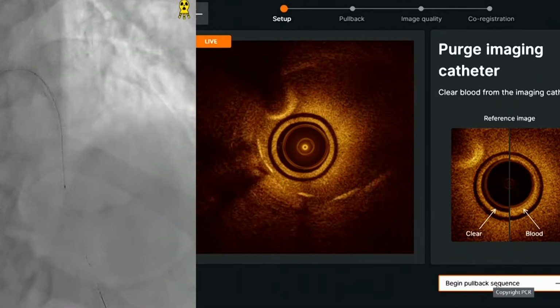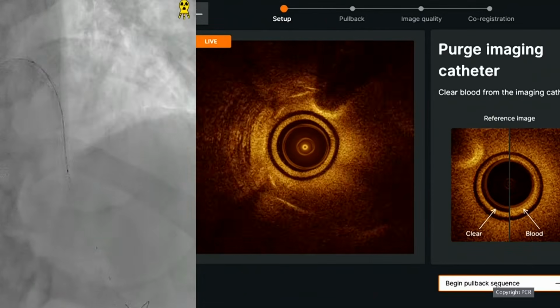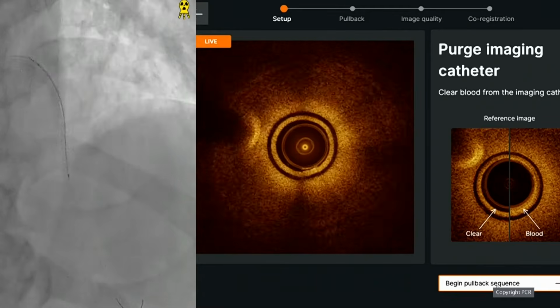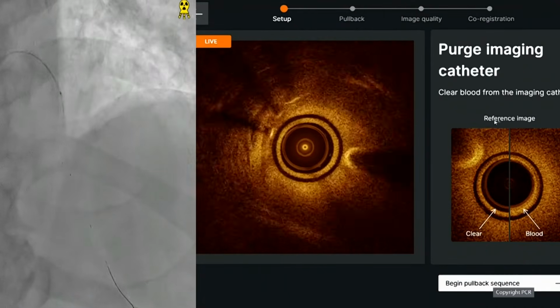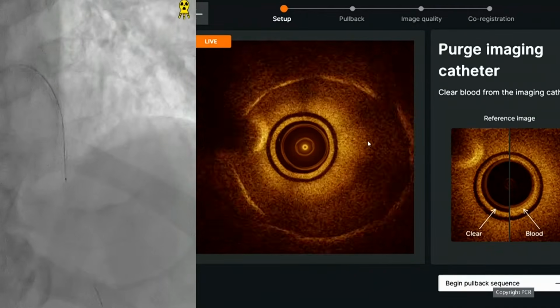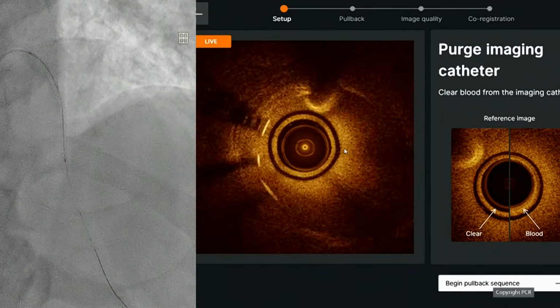So, Giulio, in this case, you would say, I'd rather go in a bit and lose the proximal and do 2? 2 millimeters should be okay. When you stop seeing the struts, it means that you are outside. Okay, we are at the limit, but I don't want to make things too complex. Anyway, the first thing to be checked is the outside part. There's a comment from the floor.